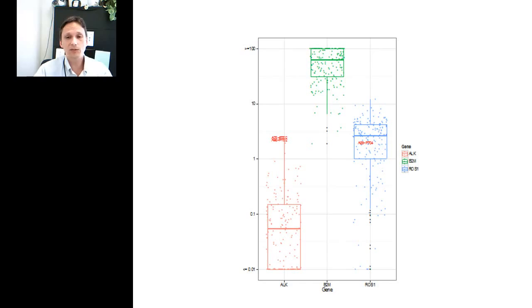This is one example, a recent data set, again, 200 lung cancers, where we have ALK expression and ROS expression. ALK, you can see up here are mapped. Zhong Li has mapped the ALK fusion positive cases, which we know express a lot of ALK, versus the cloud of ALK negative cases. So we think we're really seeing true expression profiling.